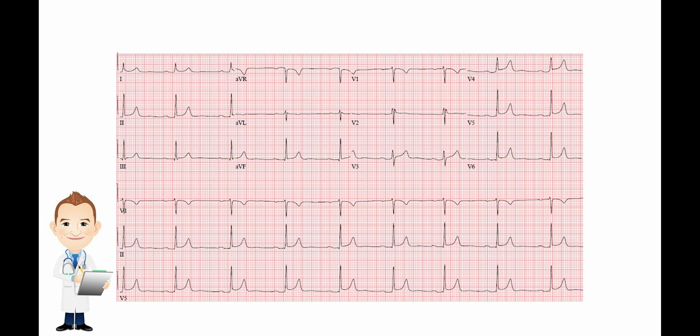In this next EKG, you're looking at a rate that's a little bit bradycardic. Counting the complexes: 1, 2, 3, 4, 5, 6, 7, 8, 9 — nine times six is 54. So this is classified as bradycardic.